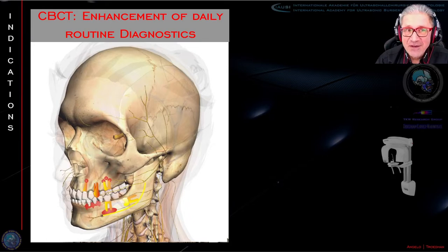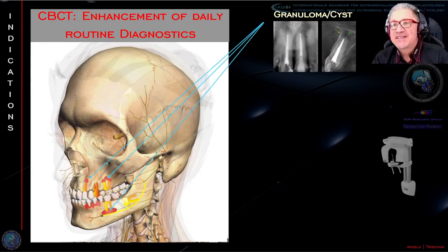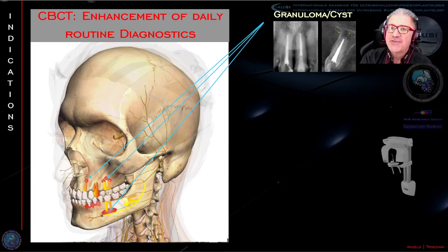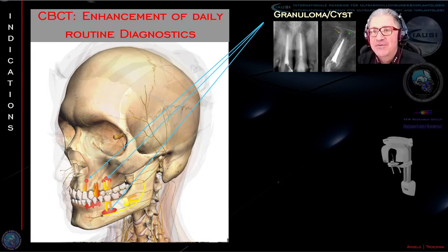Of course, we can use it also for enhancement of daily routine diagnostics, where it's very important. For instance, if you are not quite sure if a two-dimensional intraoral X-ray depicts the real issue, a patient is just complaining about pains in the upper front, then of course you might have some suspect if there could be a granuloma, but you're not sure, because the two-dimensional intraoral X-ray just is an overlay picture of different bone layers, which can give you a false positive or a false negative diagnosis. Instead, when you go into the third dimension, you perfectly see that here is definitely a granuloma.